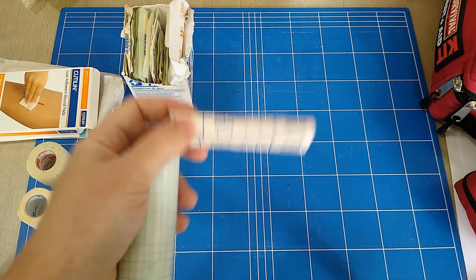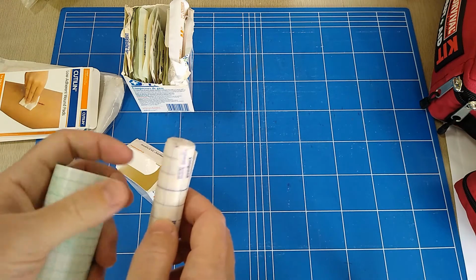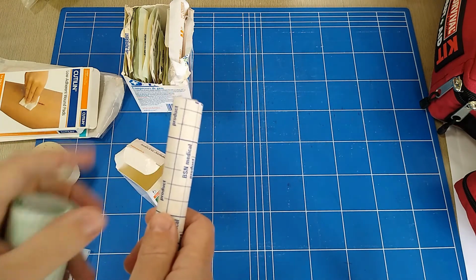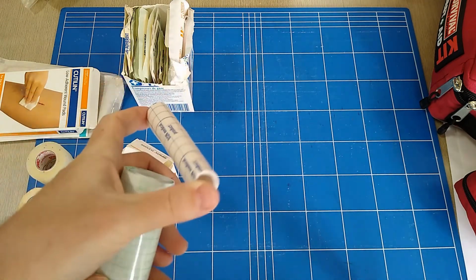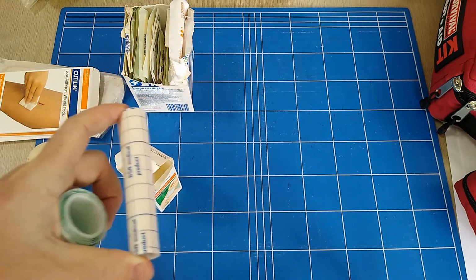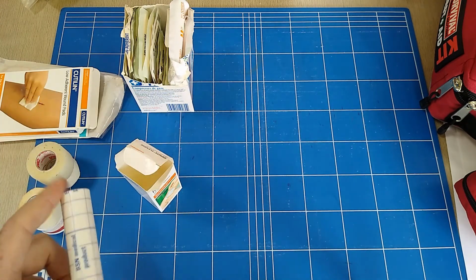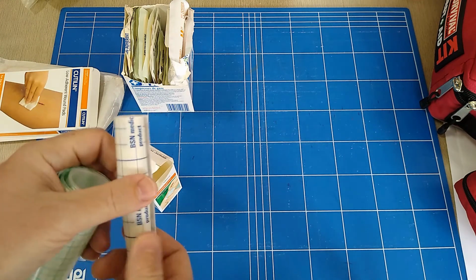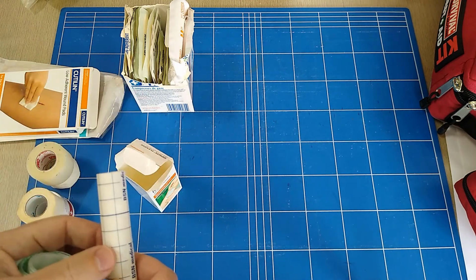It's great for making big band-aids. It's pretty hypoallergenic, and I haven't run into too many people that react to it. I've also literally used this big wide swath to cover up road rash, where it's just thin scrapes but you want to keep it clean. I plastered this stuff right over the top until it had time to shower off on its own a few days later, just to keep that big abrasion area clear.